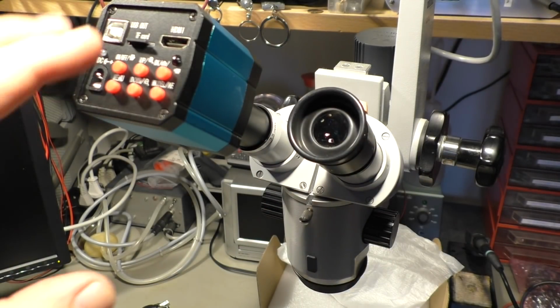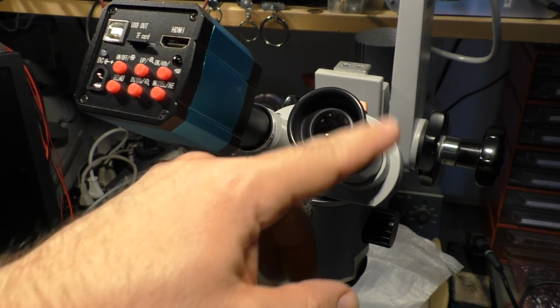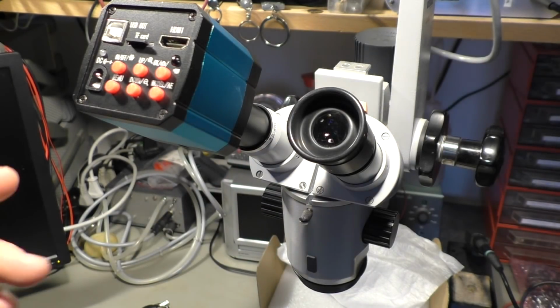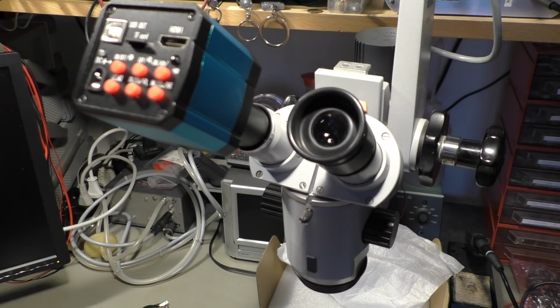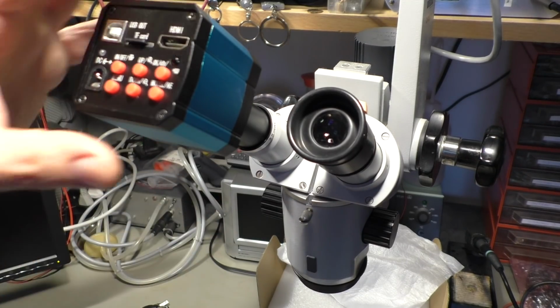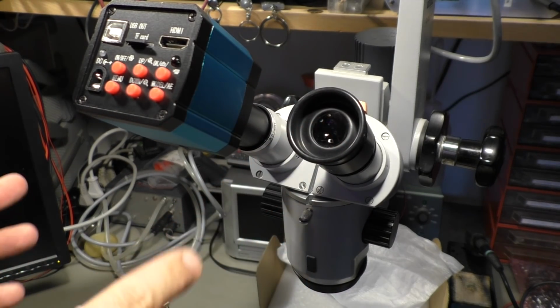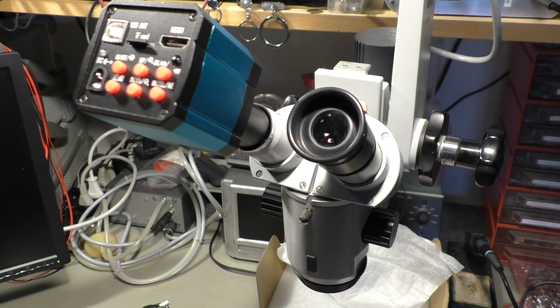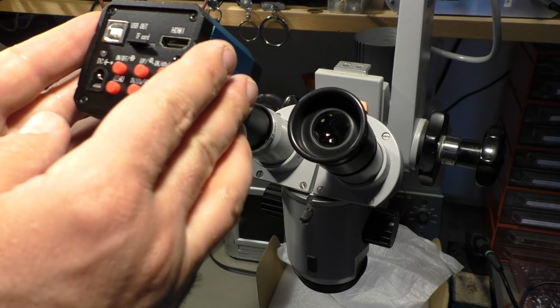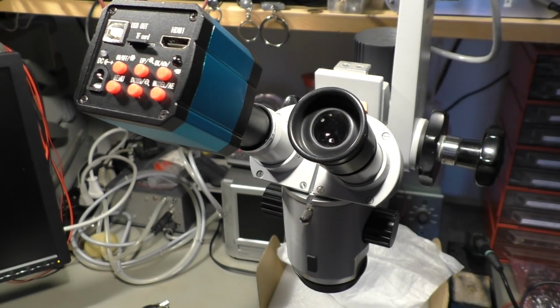My first idea was to have the camera on one eyepiece and use the other one to look through, but it turned out that doesn't work, because the camera and the eyepiece have different focus levels. So for the camera I need to raise the entire microscope higher, and then this one is blurred. Or if I have a sharp picture here, the camera doesn't see anything. So I have to decide which one I need. But for demonstrations I will use the camera, and for repair works I will use two eyepieces without the camera, of course.